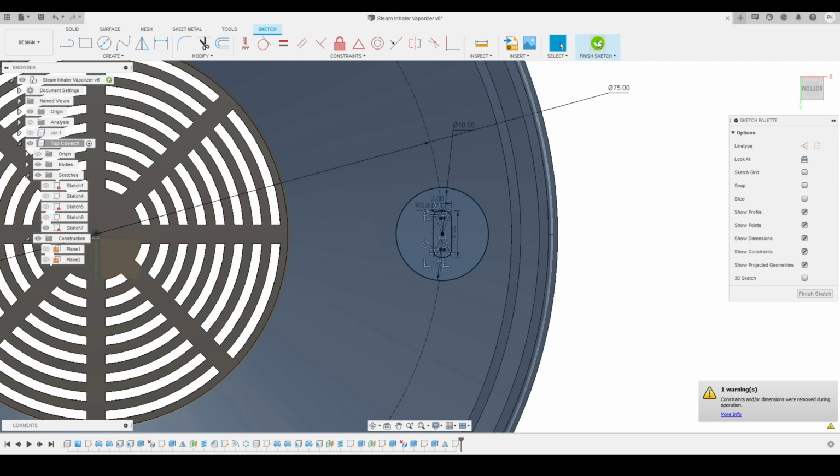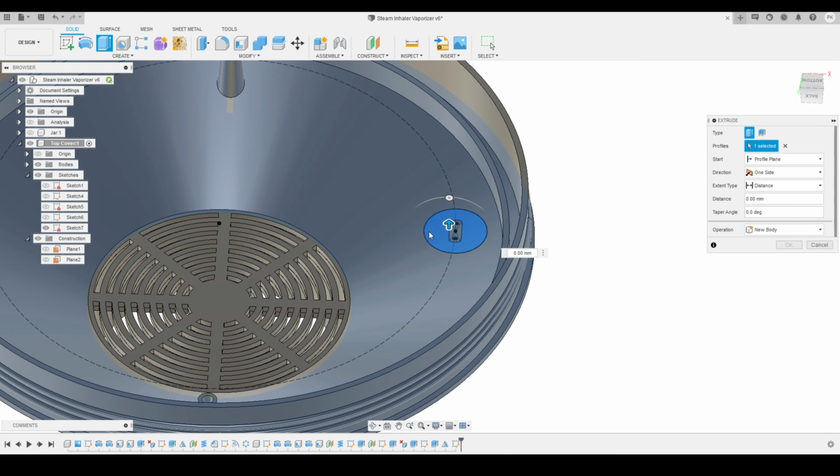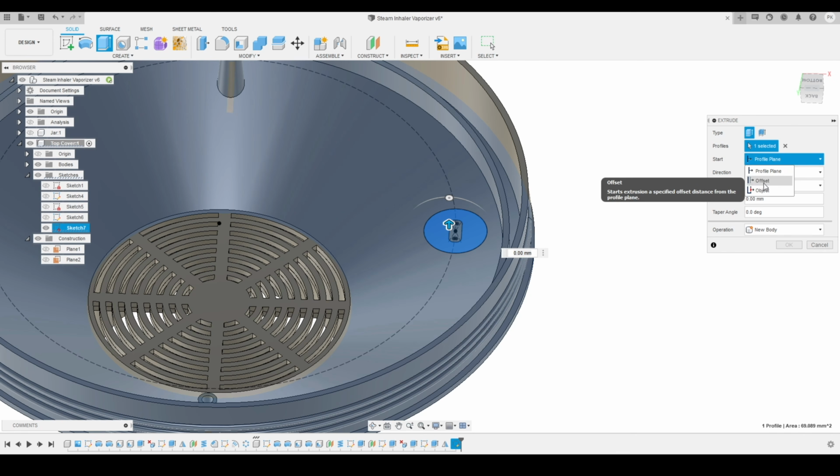Here you can see 0.8 fillet, and we'll click on the finish sketch. So this is the final profile we got. We'll activate the extrude tool. We'll select this profile, and I'm going to extrude this towards bottom direction.